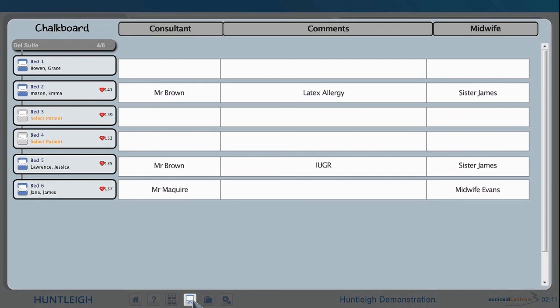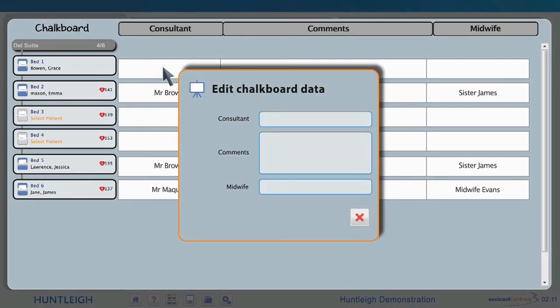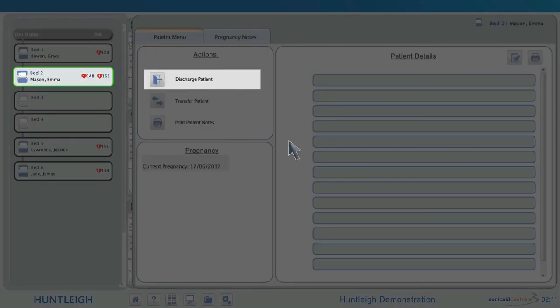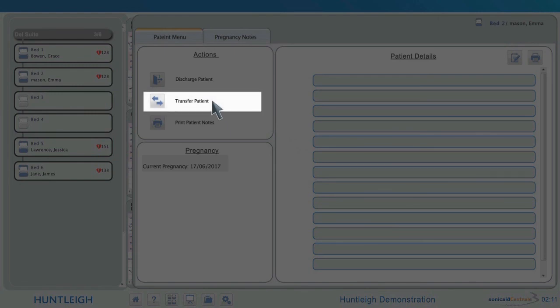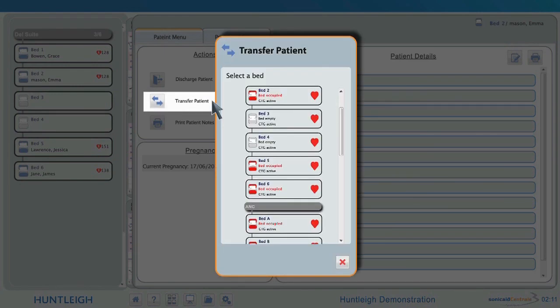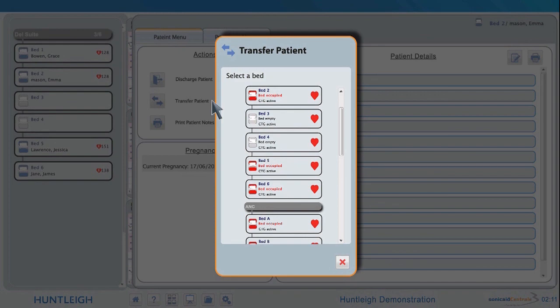The chalkboard option gives an overview of who is looking after each pregnancy, the clinicians responsible, and the current status of each pregnancy. Data can be entered or updated by simply clicking on the rows on the chalkboard and entering the data. Patients can be discharged from the system as required, or transferred to another bed or ward that is unoccupied, by selecting the patient and then the patient menu. The system can be configured to automatically discharge a patient at a set time after the CTG is switched off, simplifying use in a busy ward.